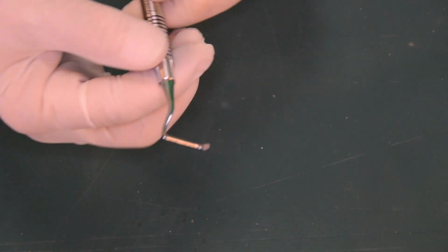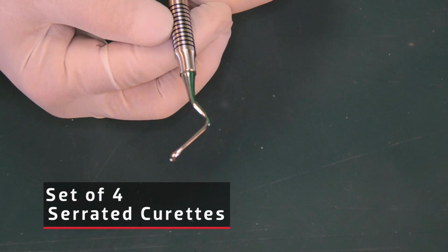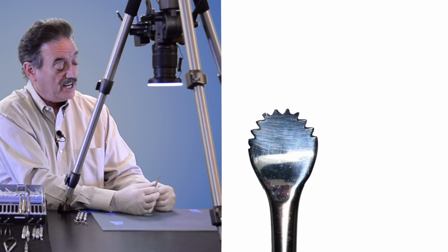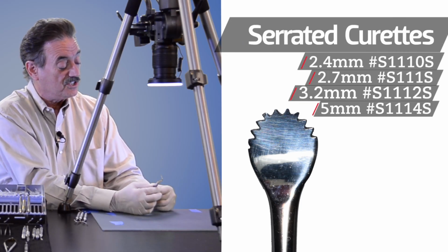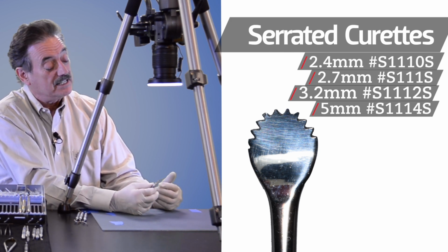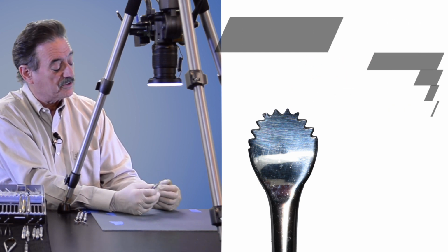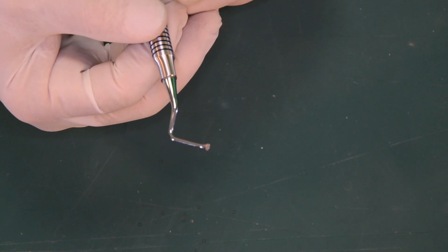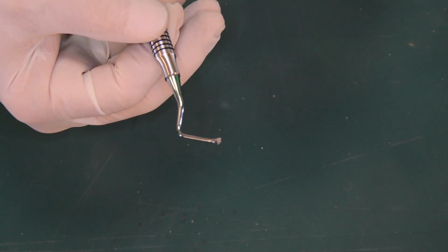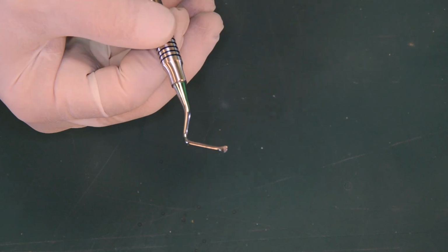The workhorse instruments are our set of 4 surgical curettes that have serrated edges. And you can see on this edge, the little serrations really enable you to get into the socket, clean that granulation tissue off the bone, and you get a real feel for the difference of bone when all the soft tissue has been removed. You can feel the difference between the smoothness and the roughness of the bone.